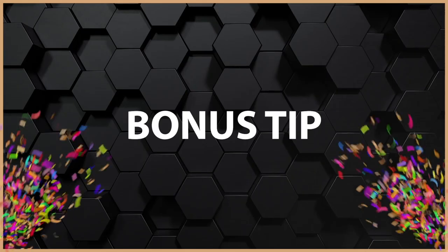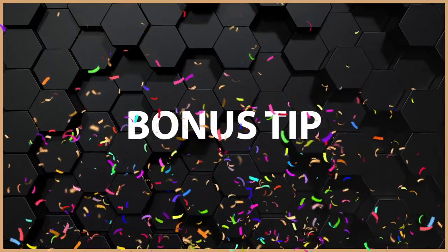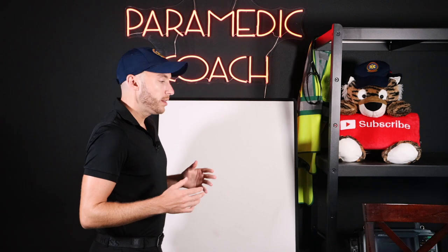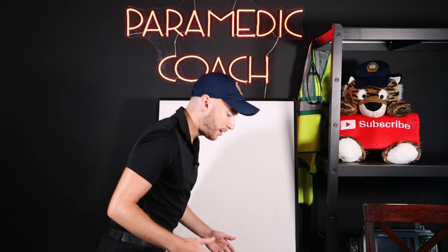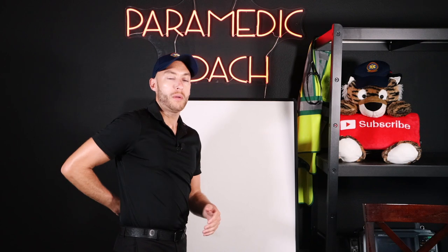Here's my super secret bonus tip you only learn from experience. When you're working in the back of the ambulance — I'll stand up so you can see me — you're not standing up completely tall at all times, especially if you're pretty tall. You're kind of hunched over like this doing patient care.